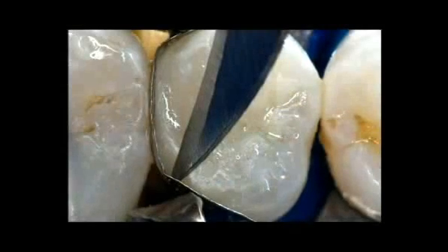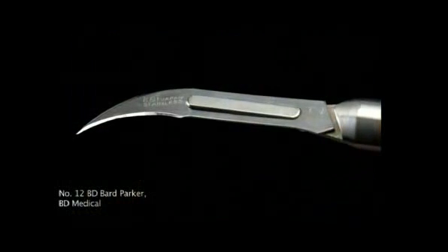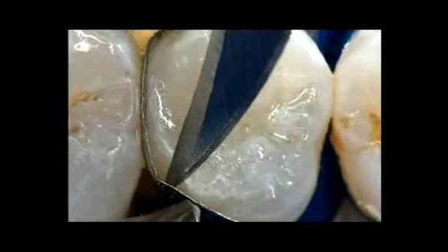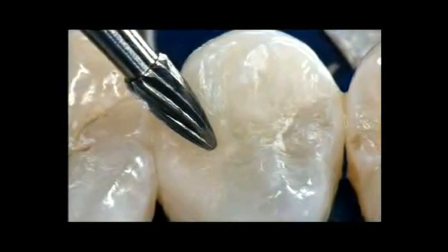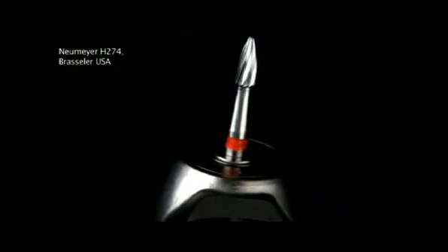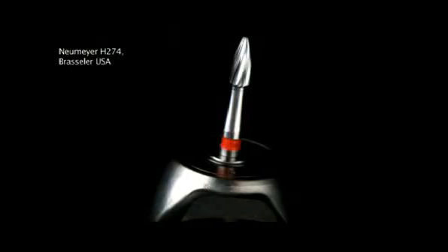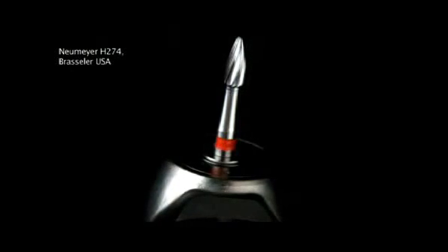Upon completion of the set, in 3½ minutes, any excess cement can be removed with a number 12 BD Bard-Parker blade to form optimal anatomical contours, especially in the interproximal zone. Any excess material can be removed and contoured with a red-banded, 12-fluted, tapered finishing bur, a Neumeyer H274 by Brasseler USA, under water spray. This bur has an ideal shape for contouring, finishing, and equilibrating the occlusal surfaces of posterior teeth.